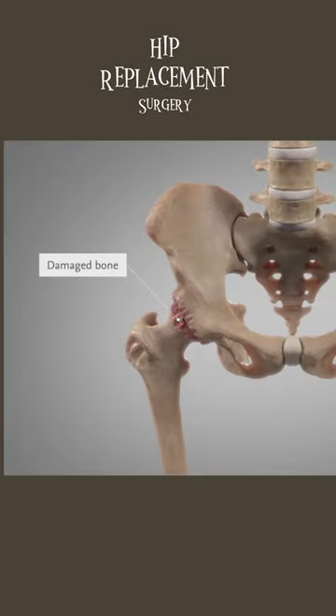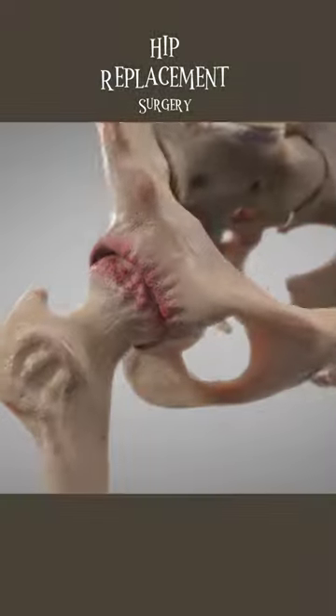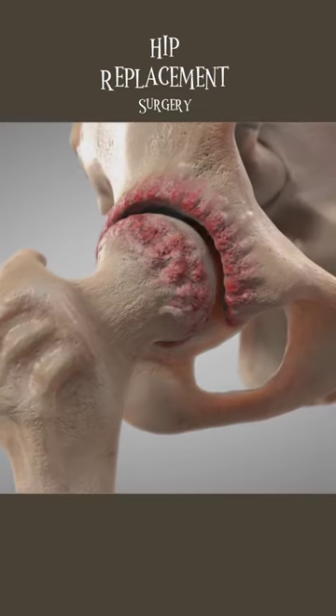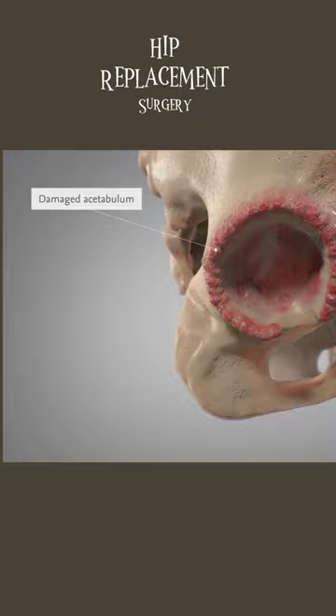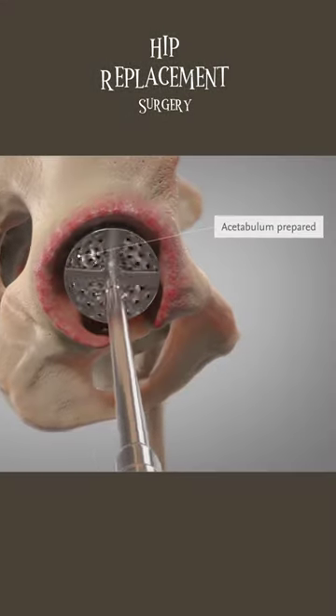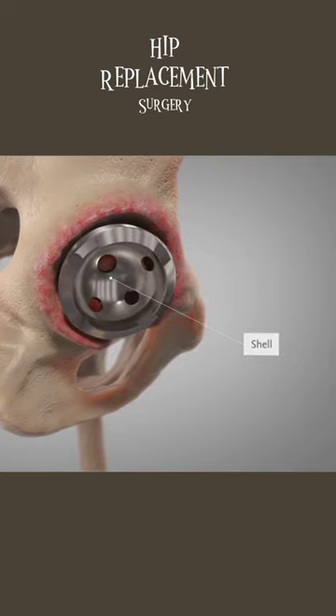A total hip replacement operation removes the damaged portions of the bone and replaces the diseased bone with parts that duplicate the ball and socket joint. The socket part of the hip joint is a cup-like cavity in your pelvis known as the acetabulum. During total hip surgery, this area is prepared and a metal shell which fits tightly into the bone is pressed into place.